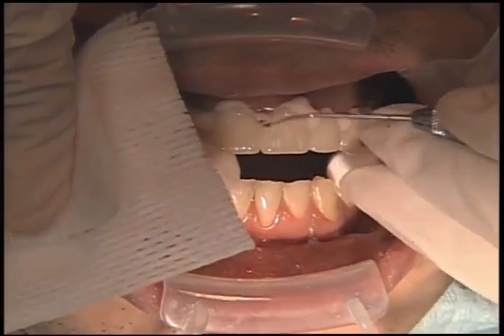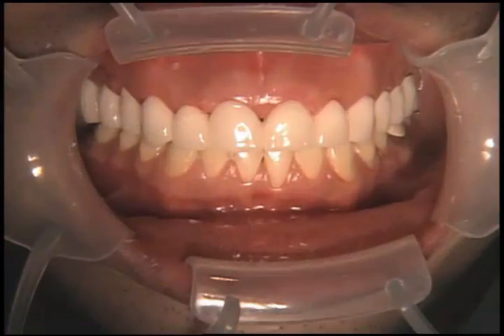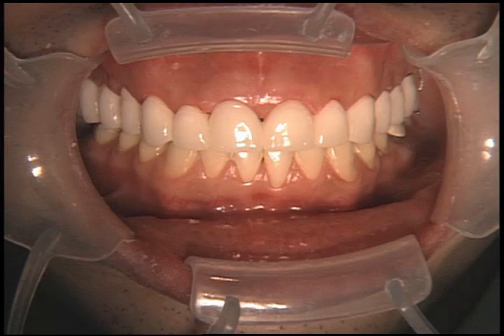I learned from one of my restorative mentors that it's not a good idea to impress on the same day you prepare almost any anterior case, but certainly a large case like this. There's a nice look at the biotemps when we're all finished and trimmed. We want to leave the gingival embrasures open whenever possible to promote healing of the gingival tissues and in order to make sure that we don't cause any recession from having gingival embrasures that are too closed.